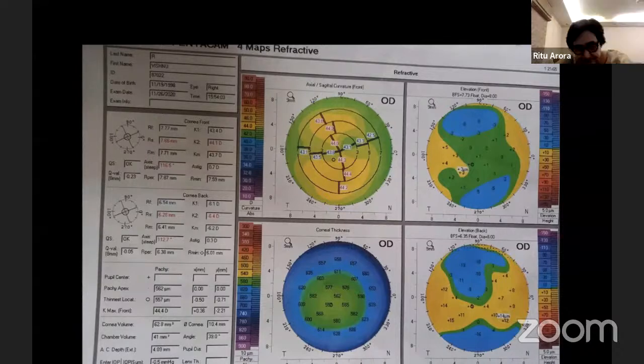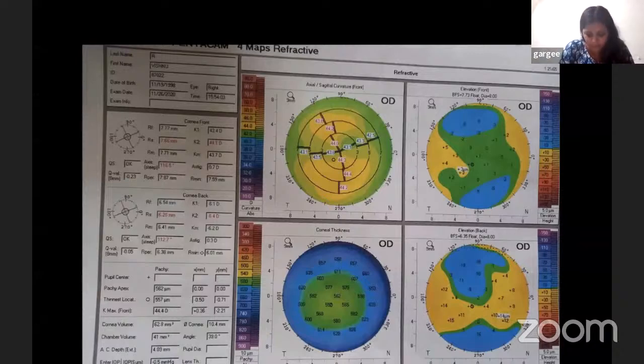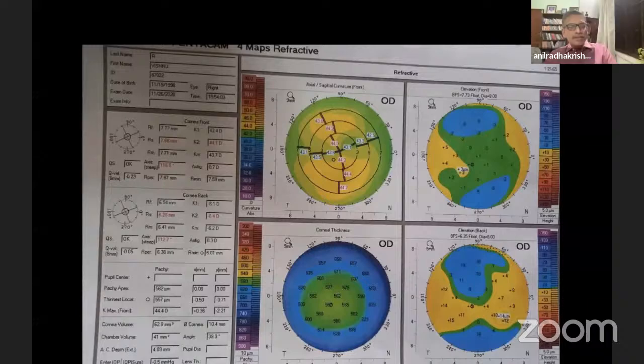Yes, Amrita. Can I ask one question? What is the normal y coordinate? Any of the postgraduates? Madam was telling about the y coordinate shift, no? What is the normal range, and above which level should you consider it as abnormal? It's less than 0.5 mm, sir. It's normal. What is it here in this?